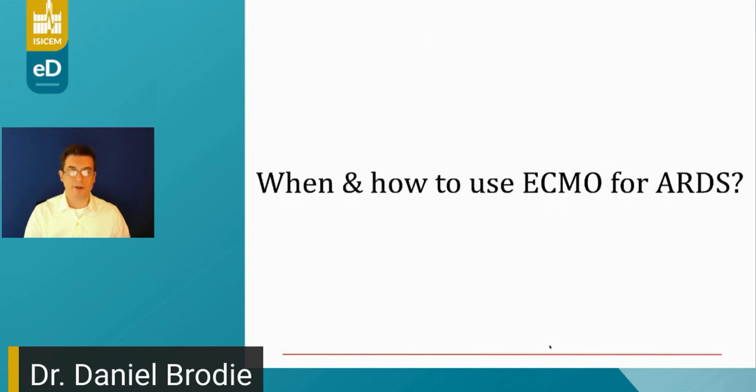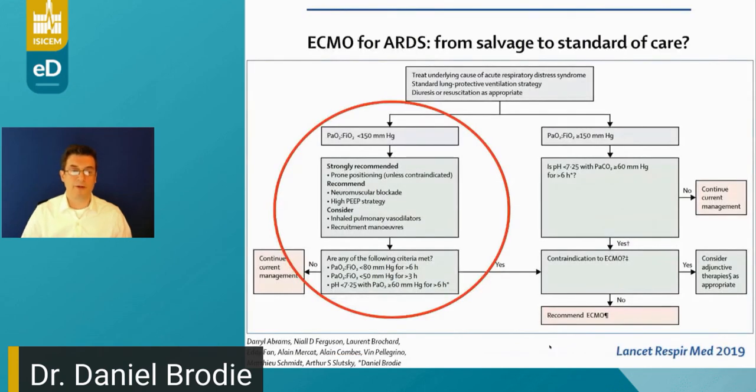So with all of that said, when and how should we use ECMO for ARDS? Ultimately, we should follow the current management algorithm for ARDS, using ECMO when appropriate after other measures have been taken. And we should use the current management approach as outlined in EOLIA or in other studies that have been done.